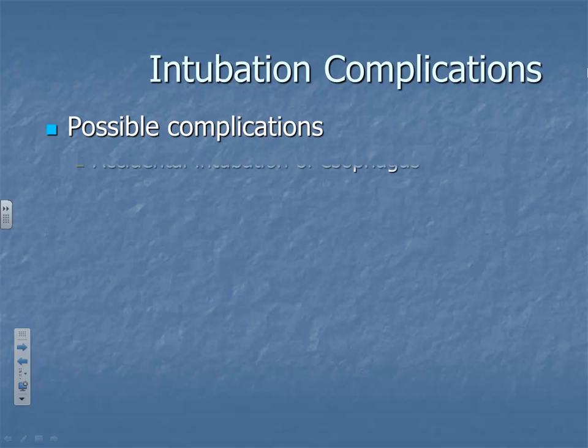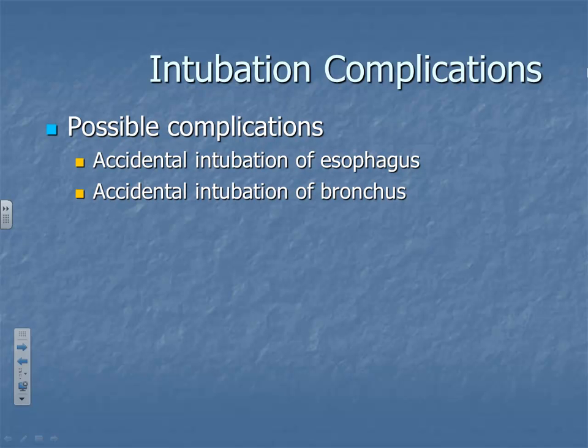Okay, intubation complications. Have we already done this? I thought we had. Accidental intubation of the esophagus. That's always bad. I think we did these, didn't we? No, we didn't talk about laceration of the lips or the tongue. Don't lacerate those things.